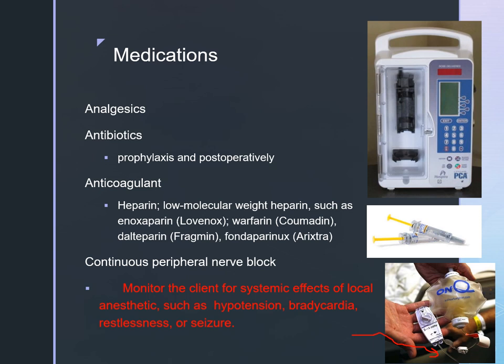What is important to know about the On-Q pump is that the dressing should always be dry, meaning if it is infusing into the skin, we're not going to see any kind of drainage or leakage on top. However, if there is a tear in the catheter's integrity, those things are very thin, very fragile, then we're actually going to see some moisture develop under the patient's dressing, as well as maybe even a little pool. If that's the case, please call anesthesia, because there should not be any kind of drainage under there. It should not be wet or moist. That's a problem to report.